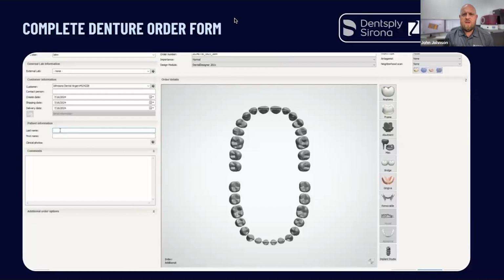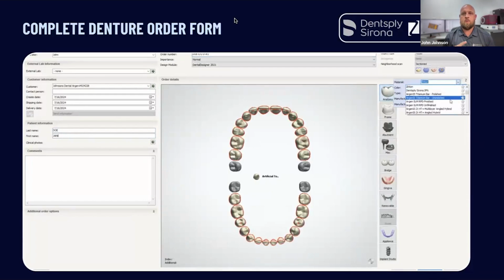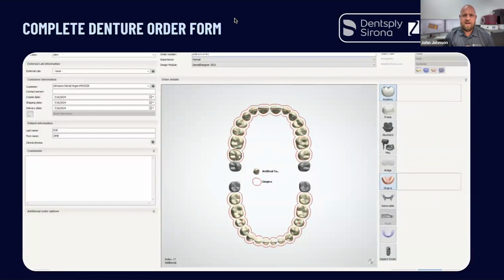Now, this is a work order. This is 3Shape, and I'm setting up a work order for a complete denture. For me, when I jumped into this, it's the biggest thing that you've got to learn early on, and that's just how to set up your work order. Because what 3Shape did is they created this screen where we can tell it that we want to make crowns, bridges, dentures, partials. So they had to make this screen where it's all there in front of you, and you have to have the ability to tell it what it is. It's kind of racing faster than my words.